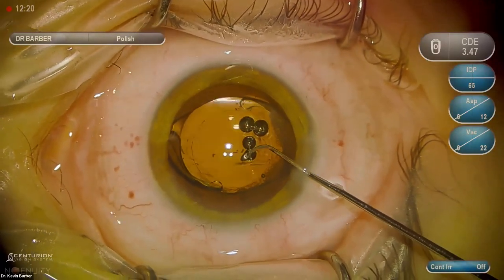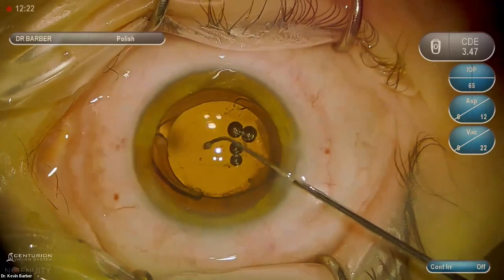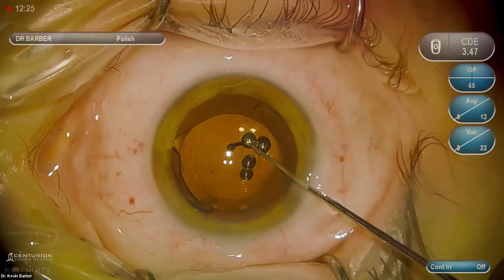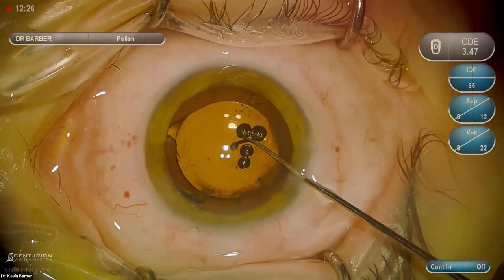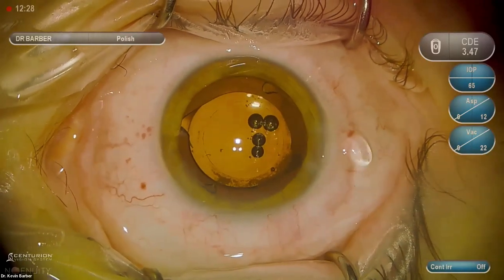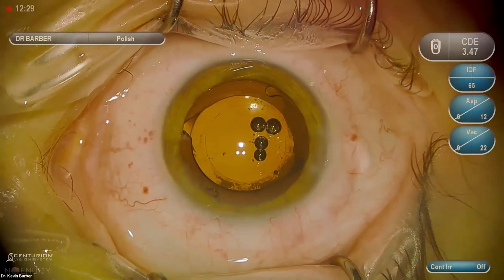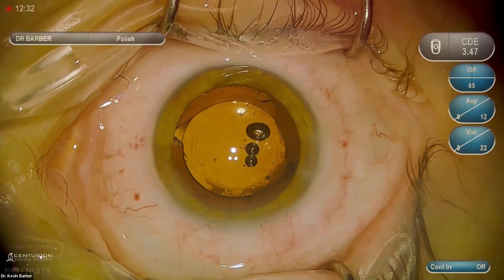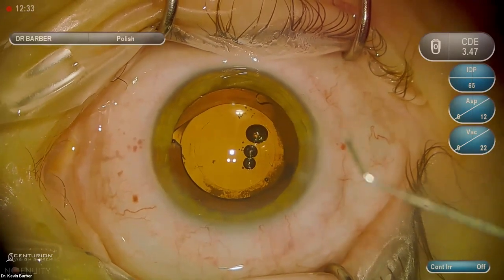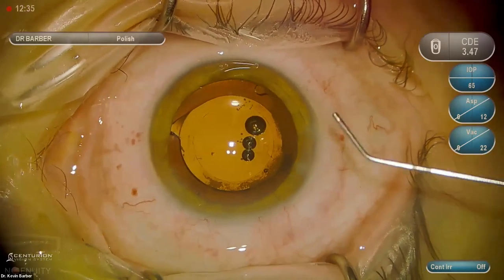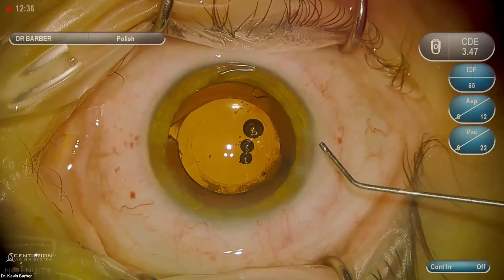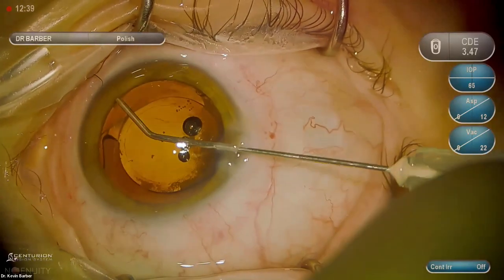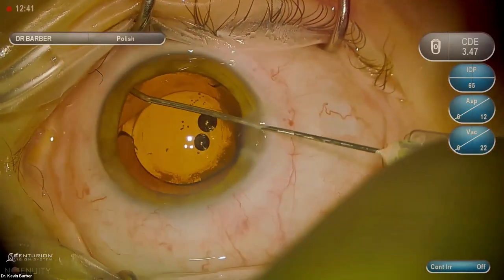This is the Panoptics — the multifocal or trifocal lens. I want to focus in on it — you can see the rings. Those rings are the good and the bad of this lens; pretty much every lens we use has positives and negatives. Now I'm giving an intravitreal injection of Trimoxy — going through the zonules and injecting 0.2 cc's of a compounded pharmaceutical containing triamcinolone and moxifloxacin.